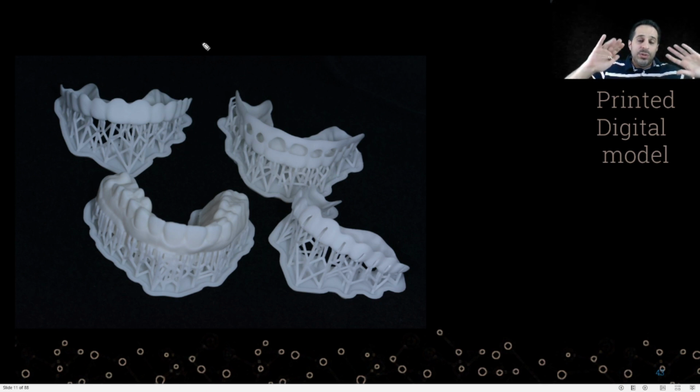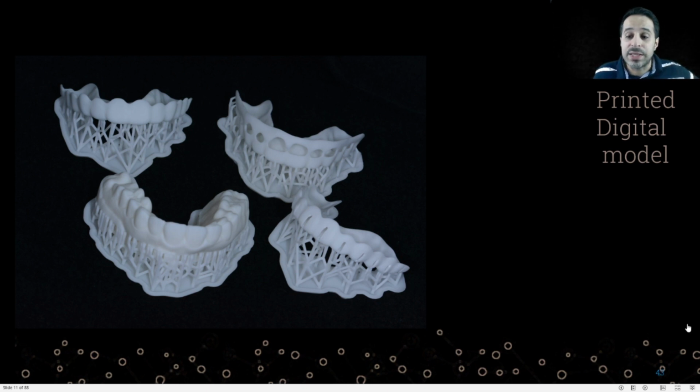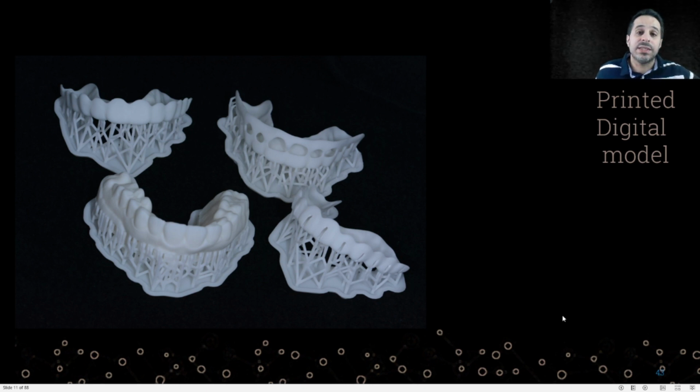So you give your lab a lot of information, and again the lab will send you back a lot of guides: a guide for the gum, a guide for the preparation, a mock-up, and also screenshots for the preparation and for the gingivectomy. All of this is still in the first visit, all this information from only the first visit.